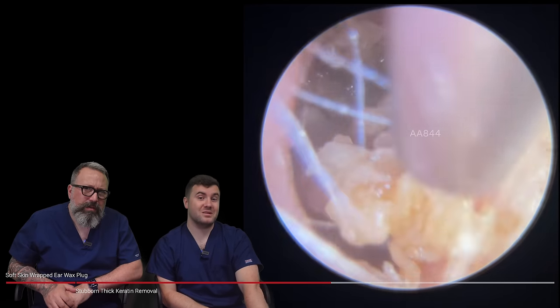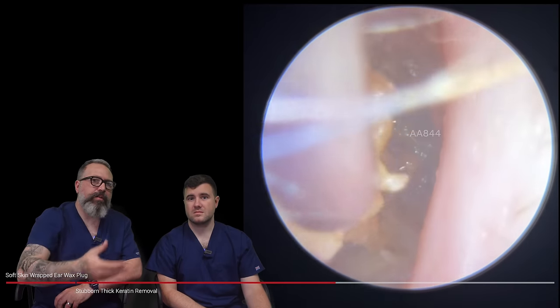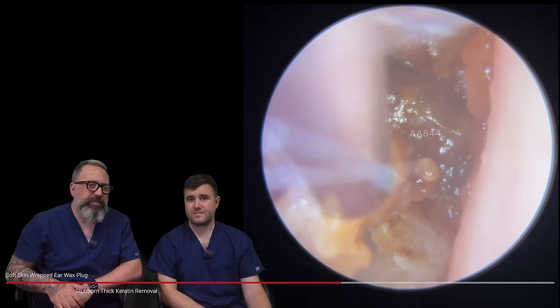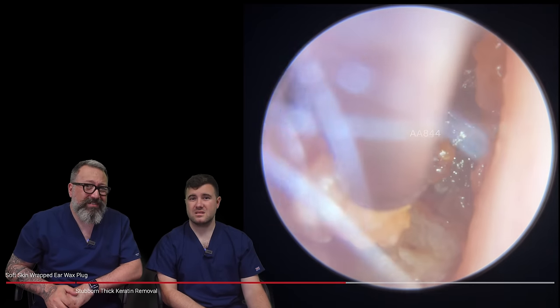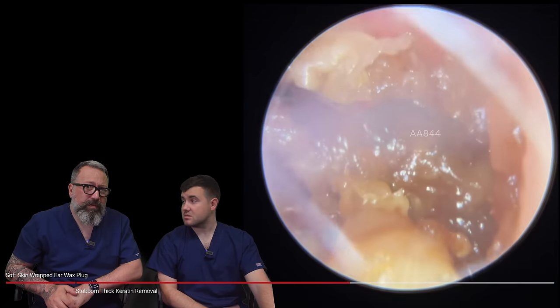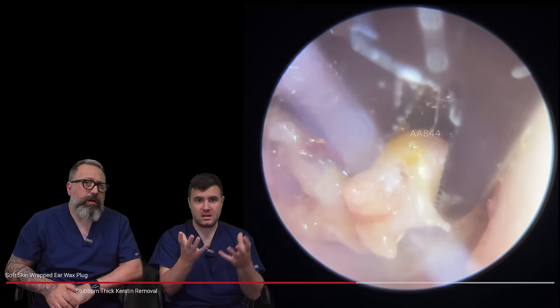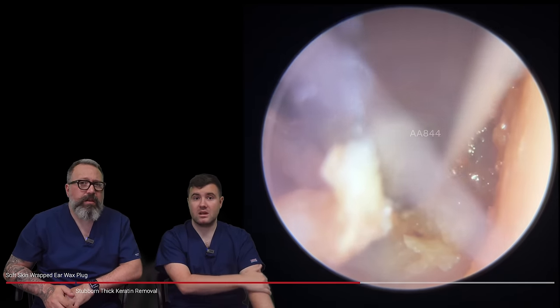What you've got to think of is this would normally be the skin that would be migrating down, forming the canal wall skin. But this has just been collecting around it, so you're not getting that lovely migration off the eardrum — it's probably going to look very mottled, you might not even see some of the features on it. The patient didn't experience any dizziness at all during this, which I was worried about especially when we were taking these thicker pieces away from the eardrum — I was half expecting the patient to start feeling a little bit squishy.